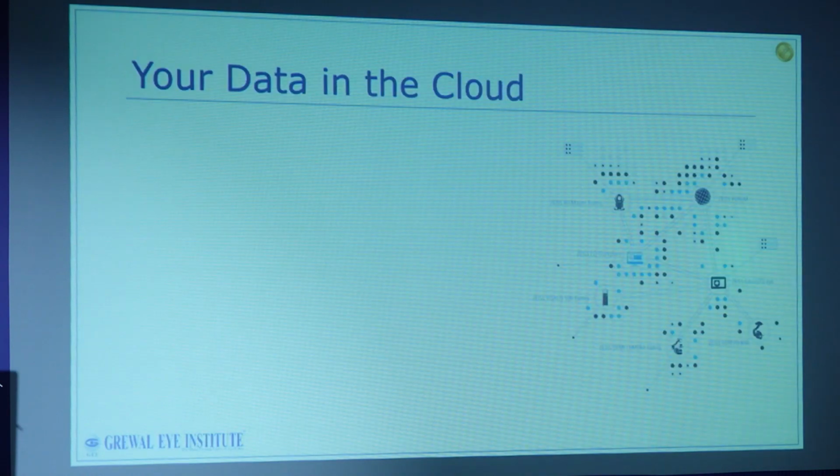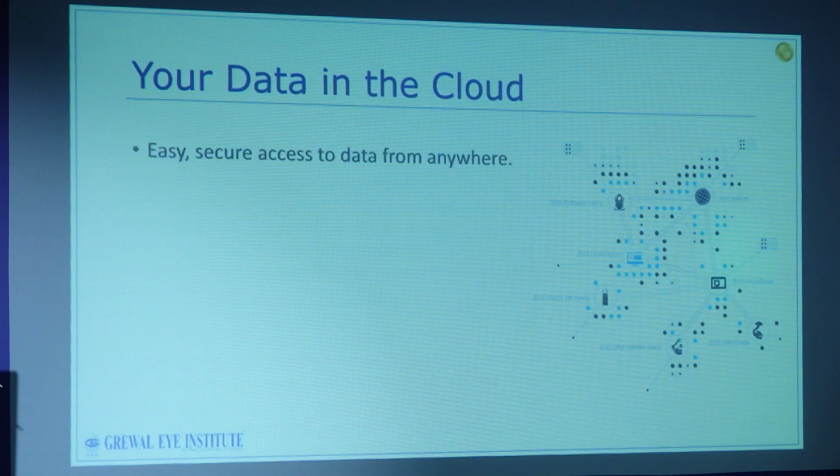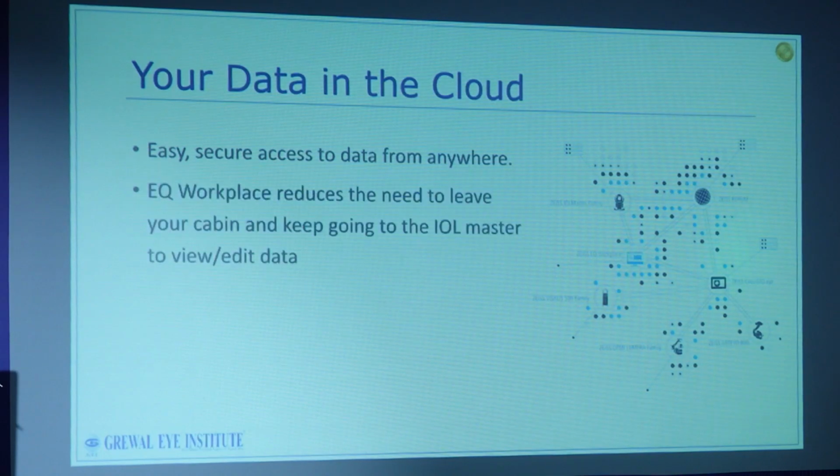When you talk about EQ, the best part about technology is also that everything is relatively seamless. So this data that is available, since it's not a hard copy that is present somewhere in your office, it's available everywhere. It can be available on any device that you're using. You don't have to necessarily be at the office. You can do all your calculations, all your planning sitting at home, so that it saves time for you when you're actually in the OR.